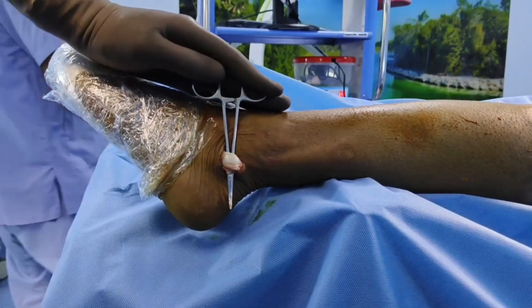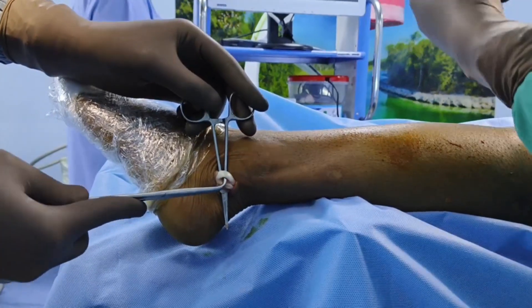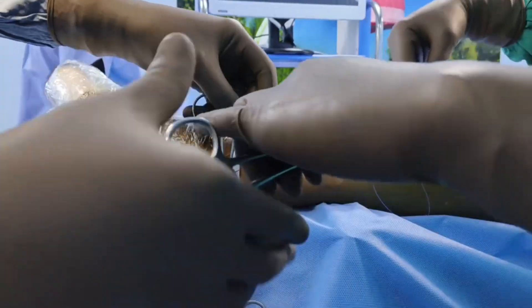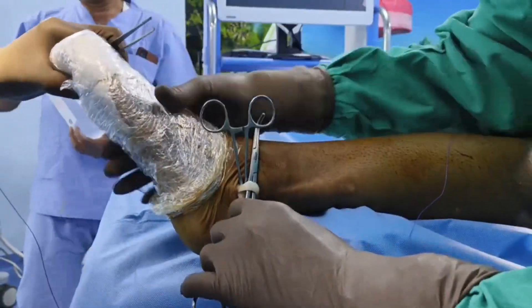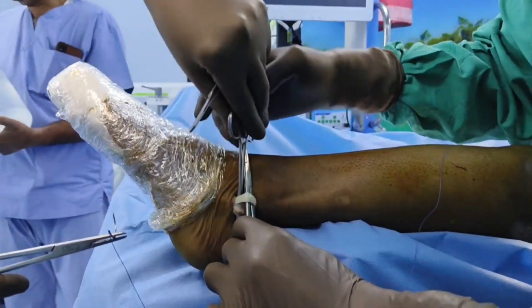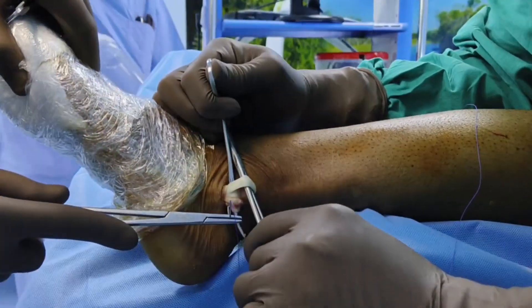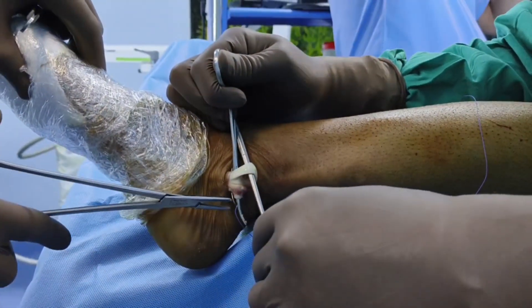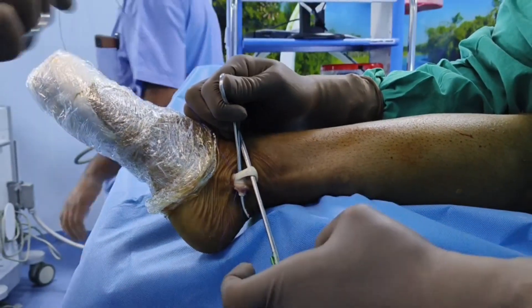To identify the peroneus longus tendon, the best way is: peroneus longus is superficial to peroneus brevis, and the second thing is peroneus longus does not have any muscle attachment at this site. Whereas the peroneus brevis, as you can see the deeper tendon, is associated with muscular tissue — so peroneus brevis is muscular whereas peroneus longus is amuscular at this point.